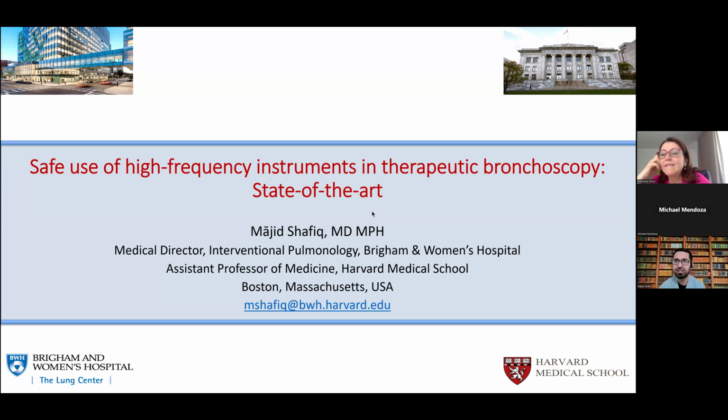So I have to say that my practice has evolved of late. My typical way to do a cryobiopsy has been to, and I know that every institution and so many providers do it very differently, right? With biopsies, there have been so many expert statements and guidelines now too, but there's a need for standardization still. My typical way has been to perform a rigid bronchoscopy, and just like you said, Dr. Simon, using a Fogarty balloon. That has been my approach typically too.